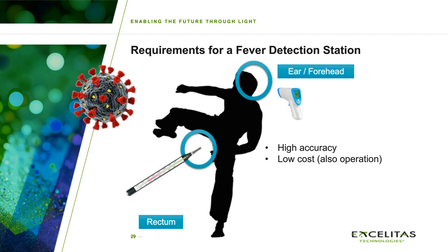Then fast, high throughput and high cleanness. This is the major reason why you cannot have contact type thermometers. And even the ear canal measurement is a contact type. You need to stick this probe into the ear. So at the end, for such a fever detection station you are left only with a forehead temperature measurement.